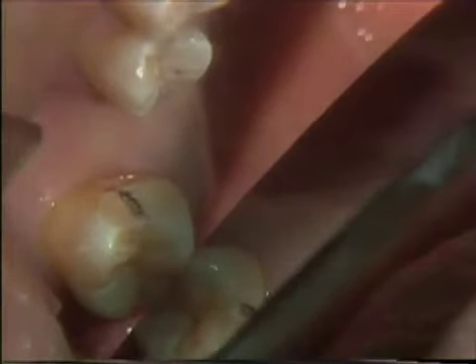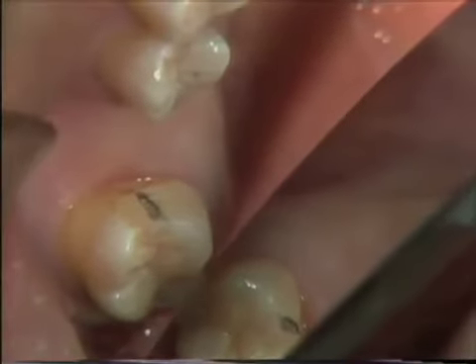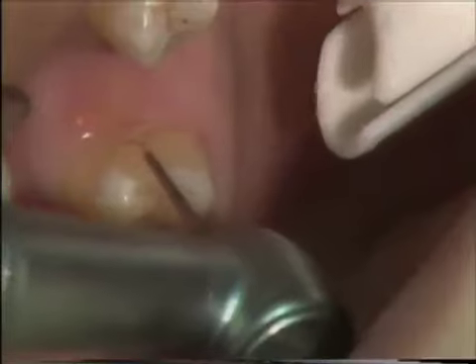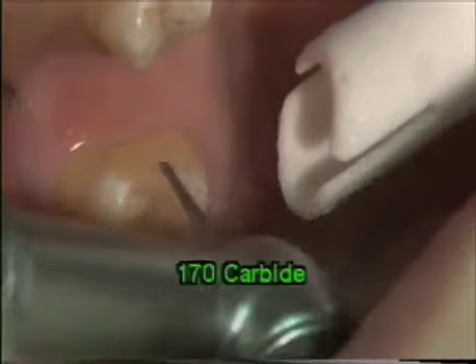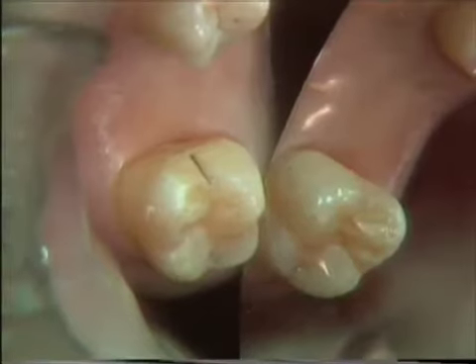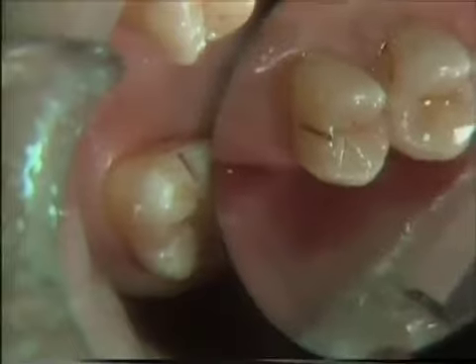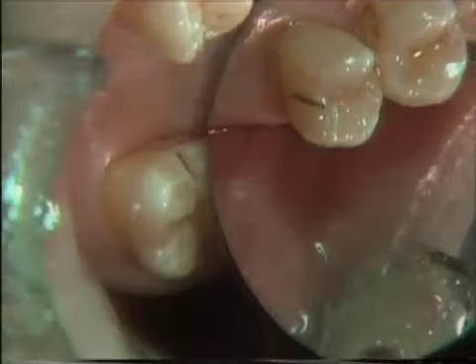Once that is correct, we simply take a 170 carbide bur, remove the pencil mark, and we have the groove in the proper position. This need not be a deep groove — just a slight groove. Place the groove on the mesial of the molar and rotate the mirror so you can see the groove, then check the distal of the bicuspid. When we look at this with the front surface mirror, both of those pencil marks and grooves do draw.